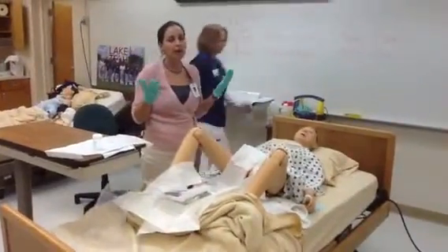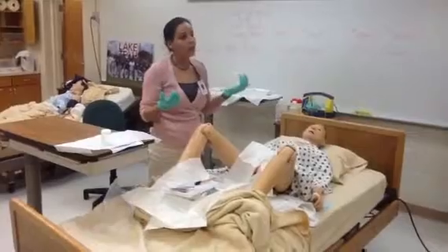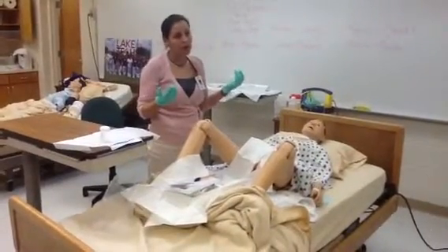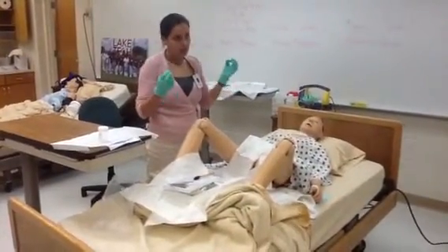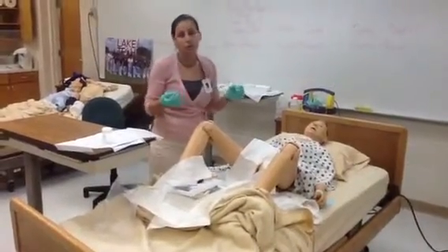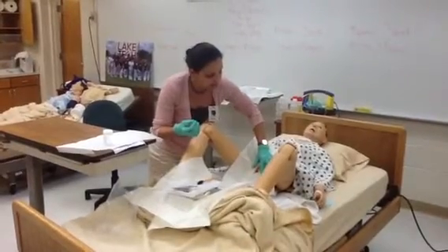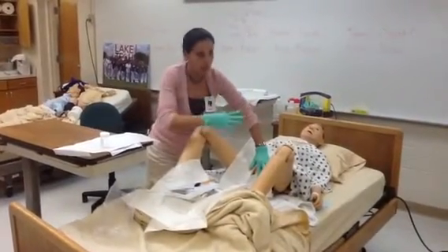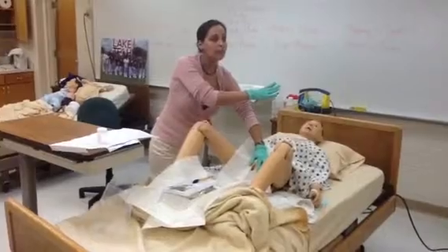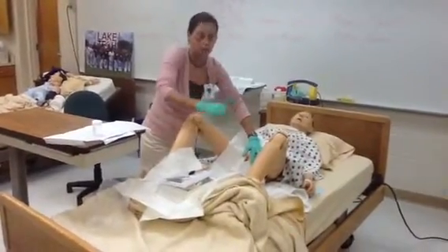The next thing that I'm going to do is take my non-dominant hand, which in this case is my left hand, and spread the labia majora and, if I can, the minora as much as I can to get good visualization of the urethra. So that'll take a movement like this to separate out. You're pulling apart and pulling up at the same time. You want to bring all that anatomy as far north as possible.